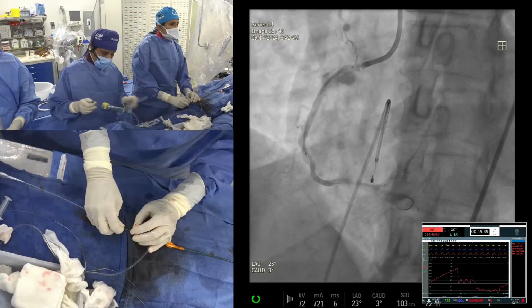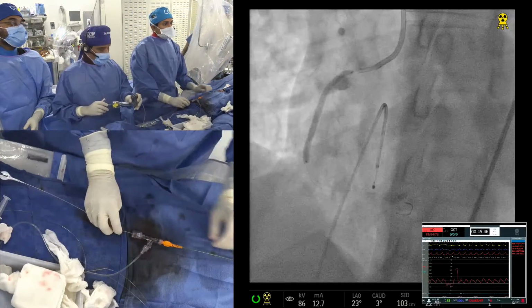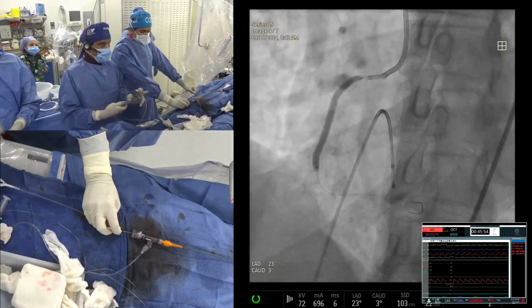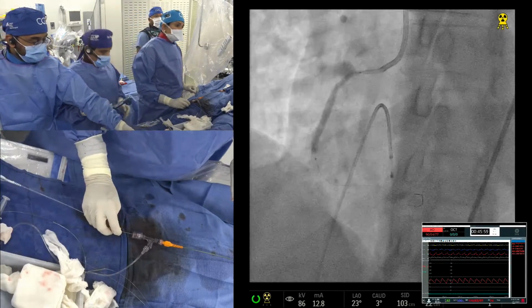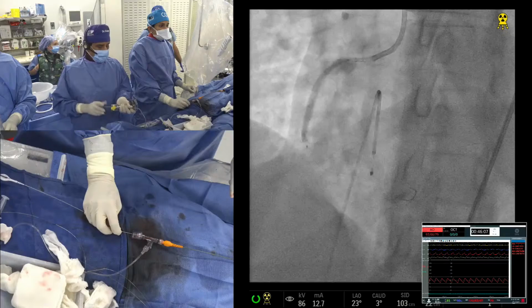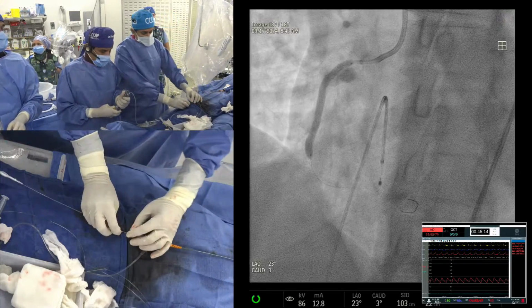The key is that the Rota cut concept is good. There are some data on cutting balloon, the COFS trial, but that was not with Rota. Only cutting balloon, going to 22, 24 atmospheres, did show a little better lumen in the calcific lesion compared to a non-compliant balloon. But overall, in enlarging the lumen after Rota, whether you use a cutting balloon or IVL, I think you go with a non-compliant high pressure balloon, and if that doesn't work, then you go with IVL.